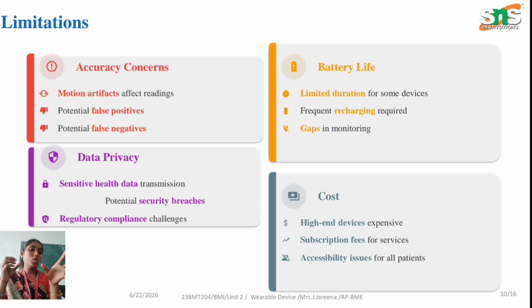And then finally the cost: higher-end devices with so many features are very expensive, and subscription fees are also there to avail some services, and accessibility for all patients is also a very big question mark. So these are the limitations of wearable cardiac monitors.